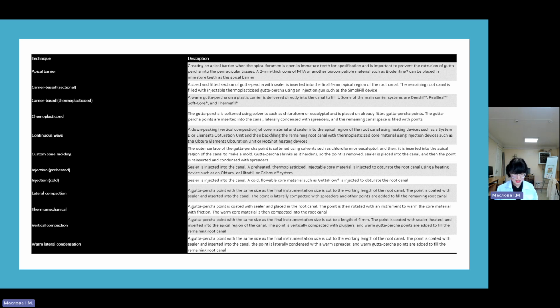Type 2 HCSC sealers and CPM sealer are based on MTA but have additives to improve their performance. This includes silicon dioxide, calcium carbonate, propylene glycol alginate, sodium citrate, and calcium chloride.